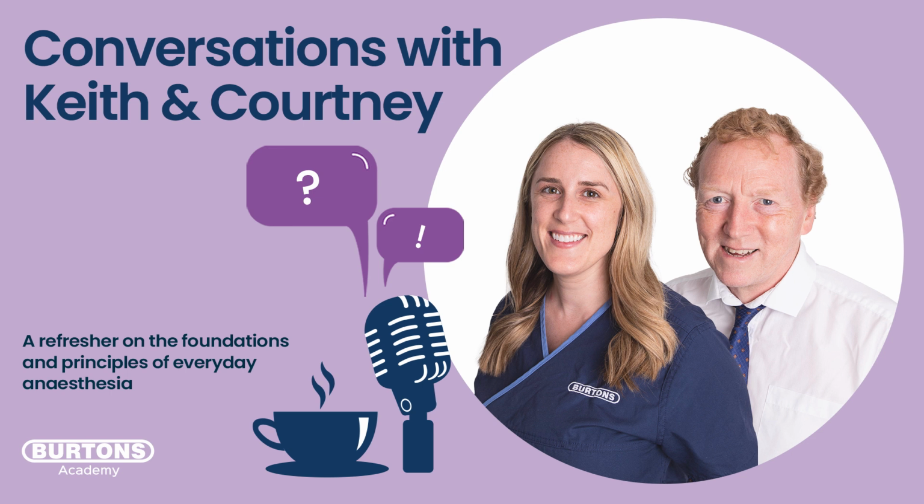So whatever you find, a bit of tongue, you put it on ears if you can. You put it across toes. You put it across the feet of a rat. You put it across the foot of a mouse. You put it across anything that will just trap a bit of arterial pulsing tissue. And it works. That's it. That's the whole point of a pulse oximeter. It only picks up the pulse.